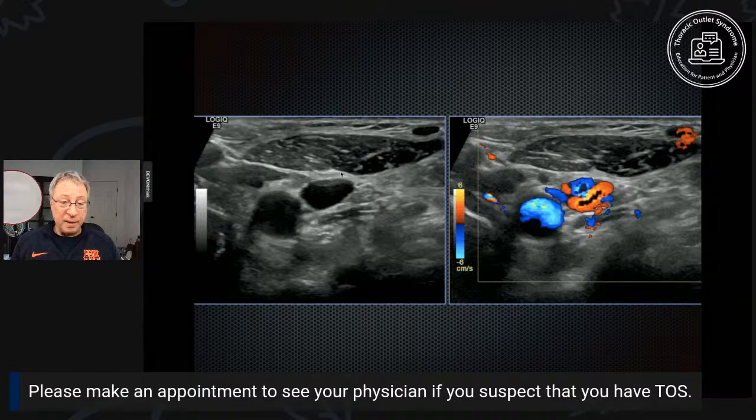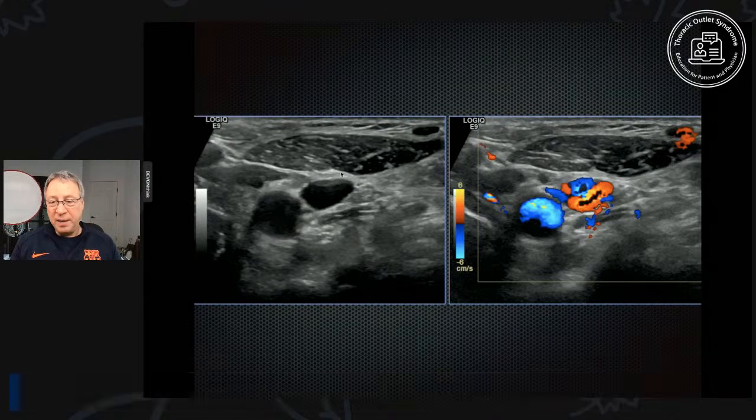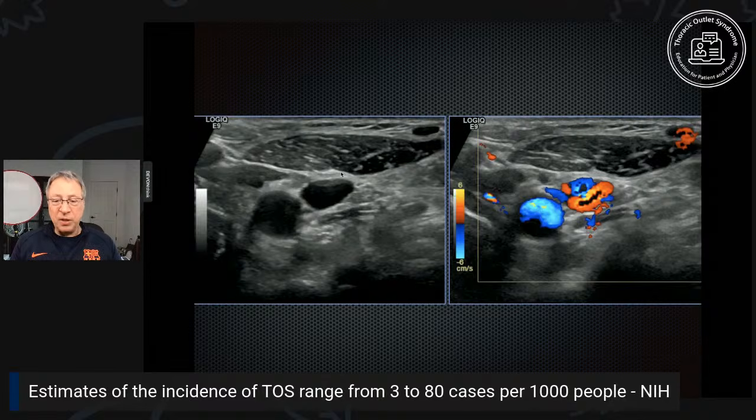Now, what ultrasound is good at is real-time imaging. You could actually have a patient move while you're watching. X-rays can't do that. These two pictures are at the same level. On the left side, you'll see there are two black holes. Those are blood vessels. One is an artery, one is a vein. And the picture on the right shows ultrasound measuring blood flow. You can see one of them is predominantly blue. That's the vein here. One of them is predominantly red. My mistake, actually, the blue one happens to be the carotid artery. And the one that's mostly red is the internal jugular vein. But the point is, you can see blood flow, not only as color, but you can measure the velocity and the turbulence of the blood flow.